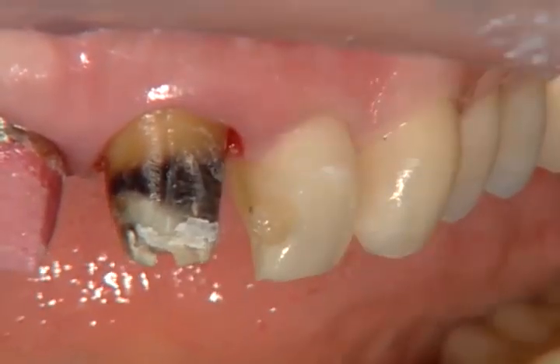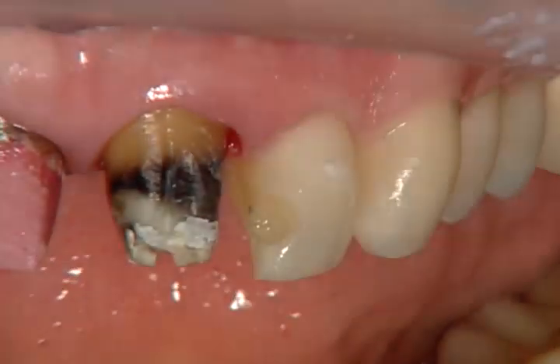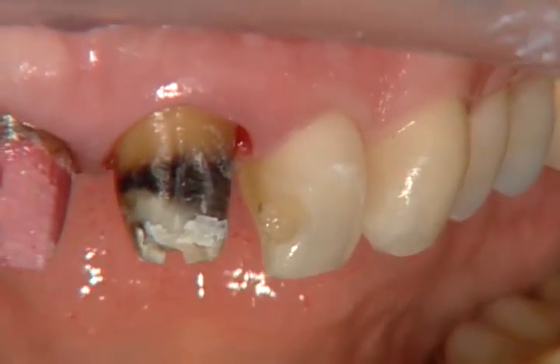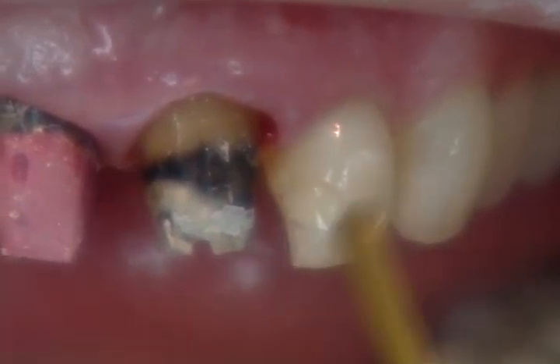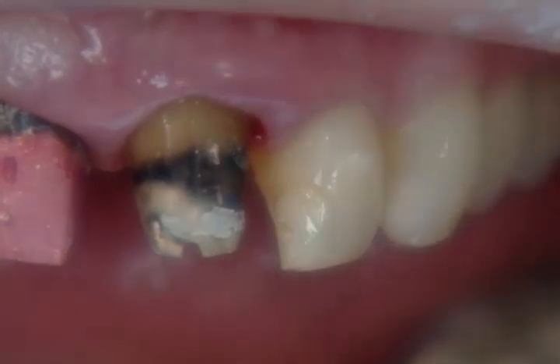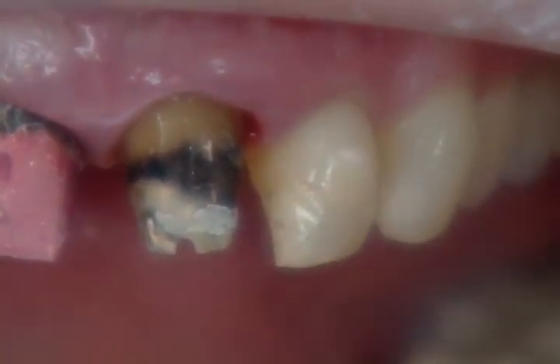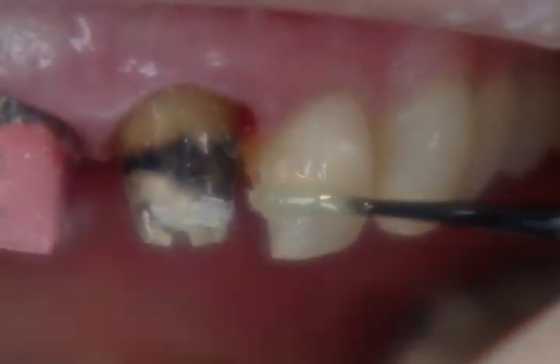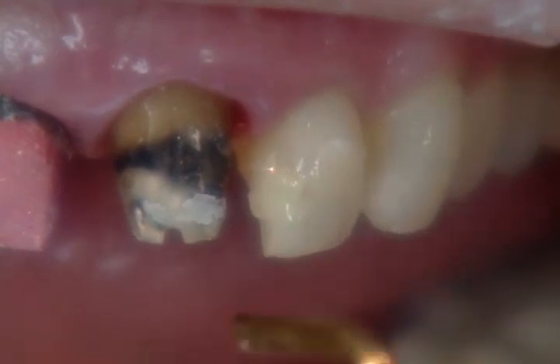So after etching for 10 seconds on dentin and 15 seconds on enamel, we place our Optibond, we air thin that, and we cure that, and now we're placing our direct composite into place with a Class 5 instrument. You just want to make sure it's well lubricated so that you can take the composite material and pull it out to the side over that bevel. You really want to pull it thin. In fact, if you try to clean too much of it over that kind of chamfer or that bevel that we prepared, you will pull it off.